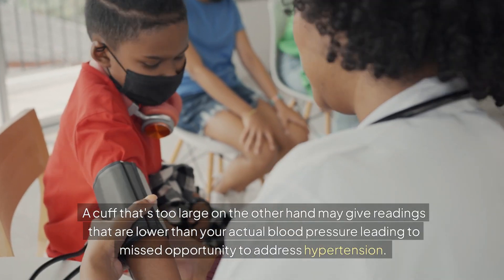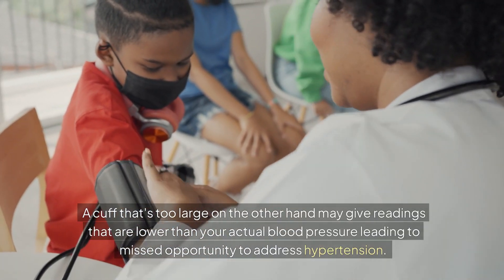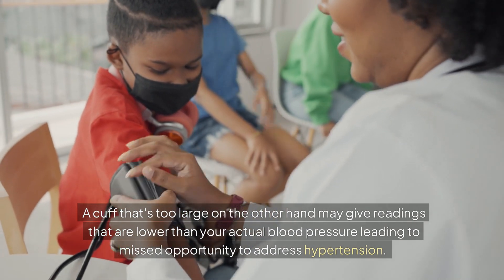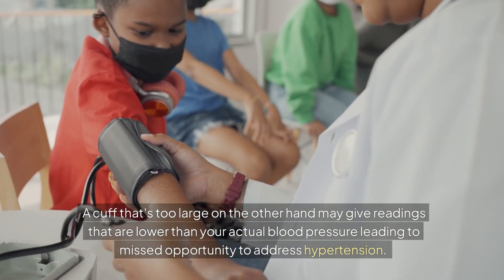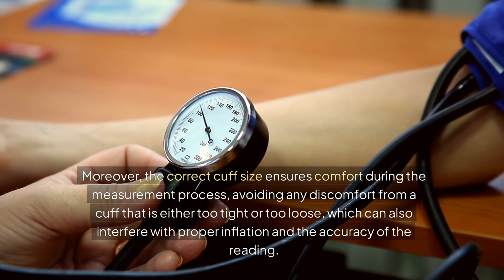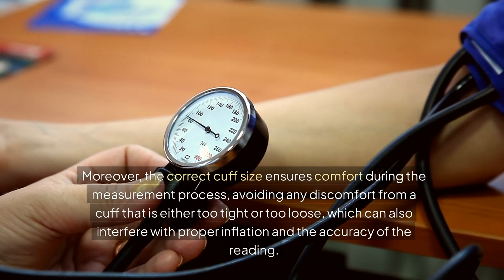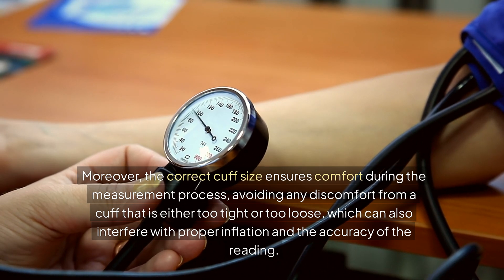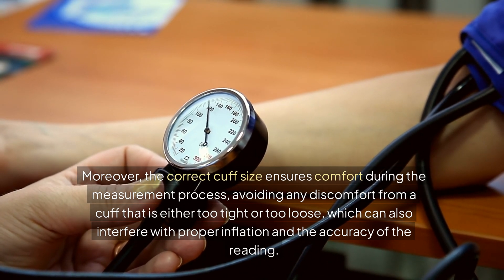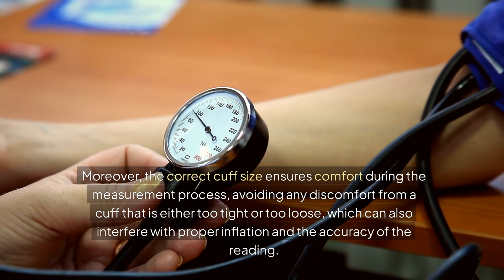A cuff that's too large, on the other hand, may give readings that are lower than your actual blood pressure, leading to missed opportunity to address hypertension. Moreover, the correct cuff size ensures comfort during the measurement process, avoiding any discomfort from a cuff that is either too tight or too loose, which can also interfere with proper inflation and the accuracy of the reading.